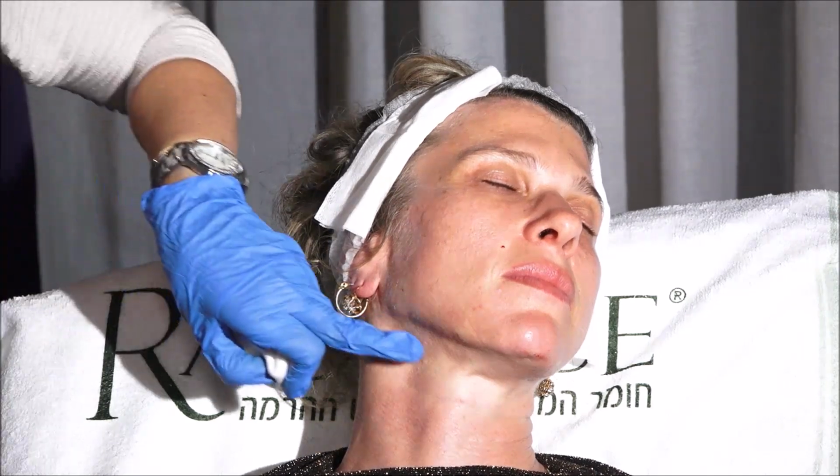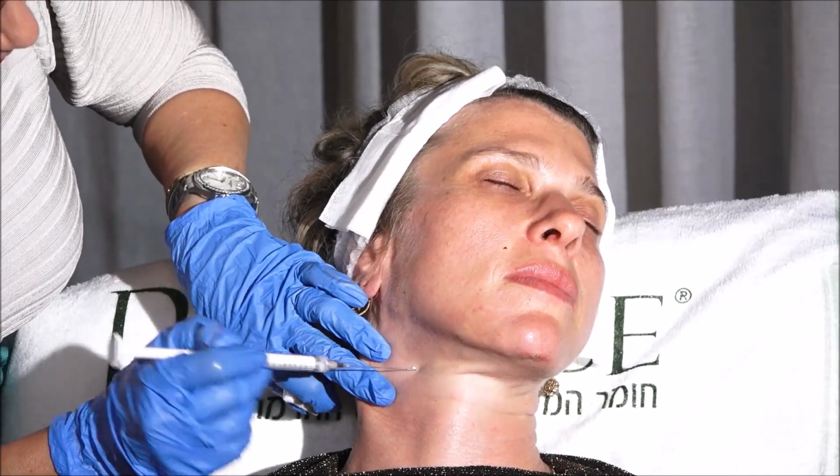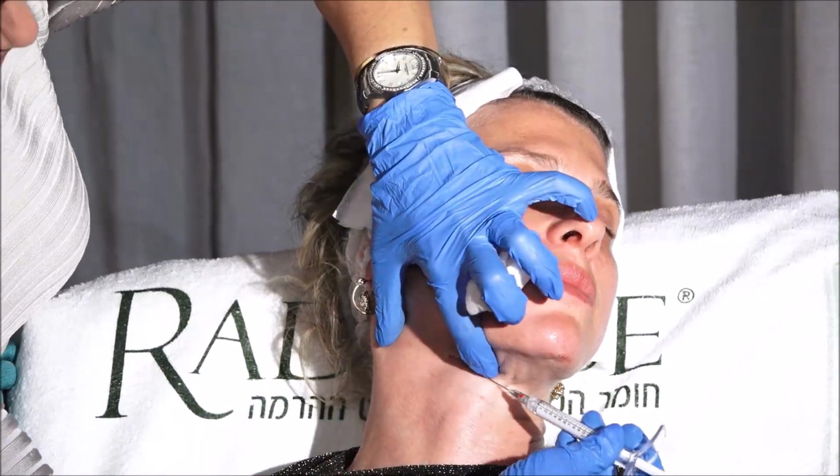So for the neck, it's easier if you get a shorter cannula. If you get a 70 here, it's too difficult. So normally, for my point of entrance, I go backwards.